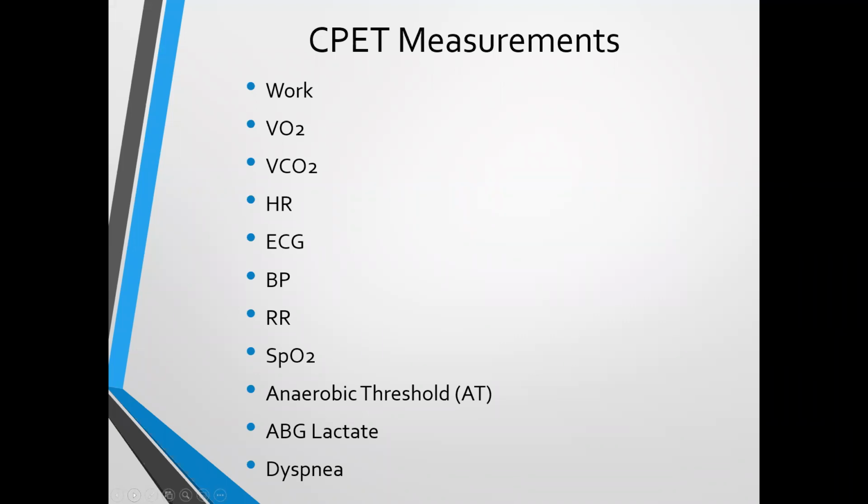Now it can be measured via an ABG, so blood lactate. And there are even iStat point-of-service cartridges that can measure it. As soon as you have the blood value, you can actually run it. It takes 2 minutes to run. So it might take you a couple of minutes to get the blood gas, and then you're running it, but you can actually have a result if you're using a point-of-service system such as iStat. You can get it pretty quickly. It's not sending it to a lab and waiting an hour, half hour, or any nonsense like that. It really depends on the facility, though.